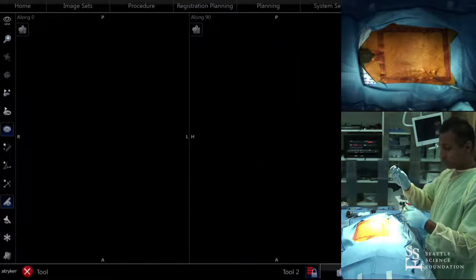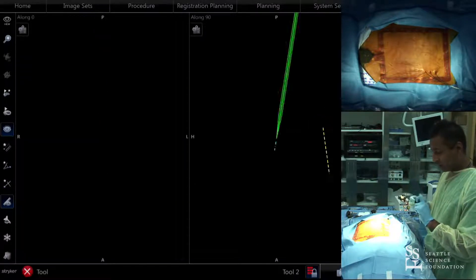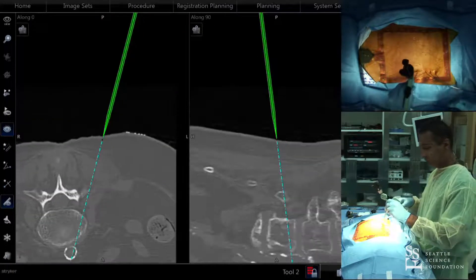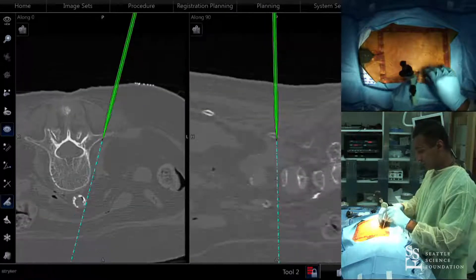I don't feel the need to push the guide wire really anteriorly, because as we've all heard, there are times when you can pass the guide wire too far anteriorly. Ultimately, if we could eliminate guide wires altogether, that would really be the ideal scenario.